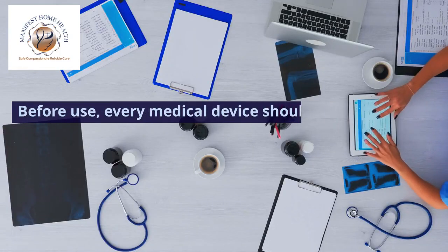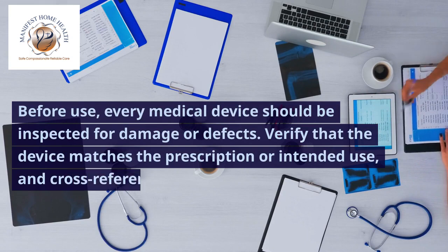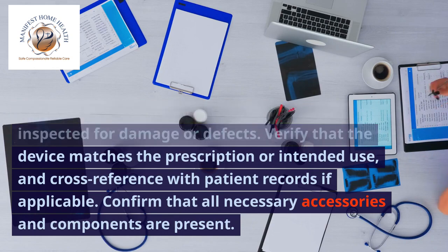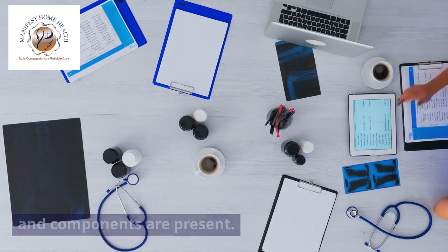2. Device inspection and verification. Before use, every medical device should be inspected for damage or defects. Verify that the device matches the prescription or intended use, and cross-reference with patient records if applicable. Confirm that all necessary accessories and components are present.